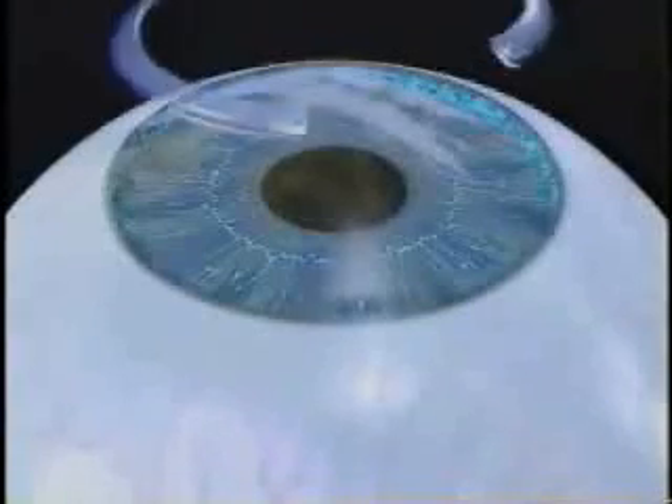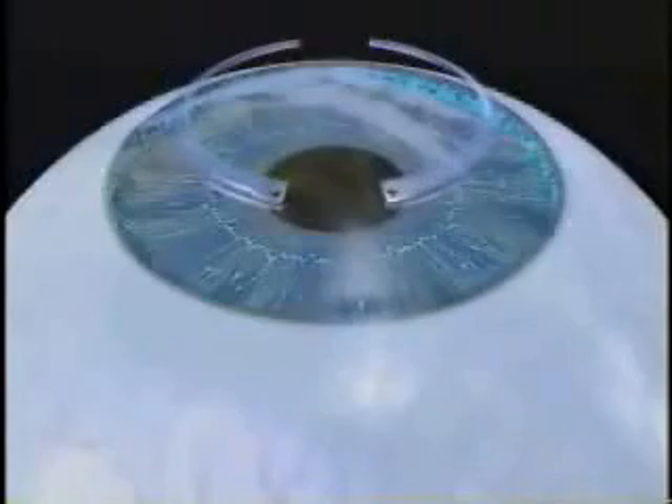Two semicircular micro-thin segments are placed within the cornea, but outside of the central optical zone. They are placed through a tiny opening less than 2 millimeters wide. The ring is gently inserted into the opening, resting between the natural layers of the cornea.